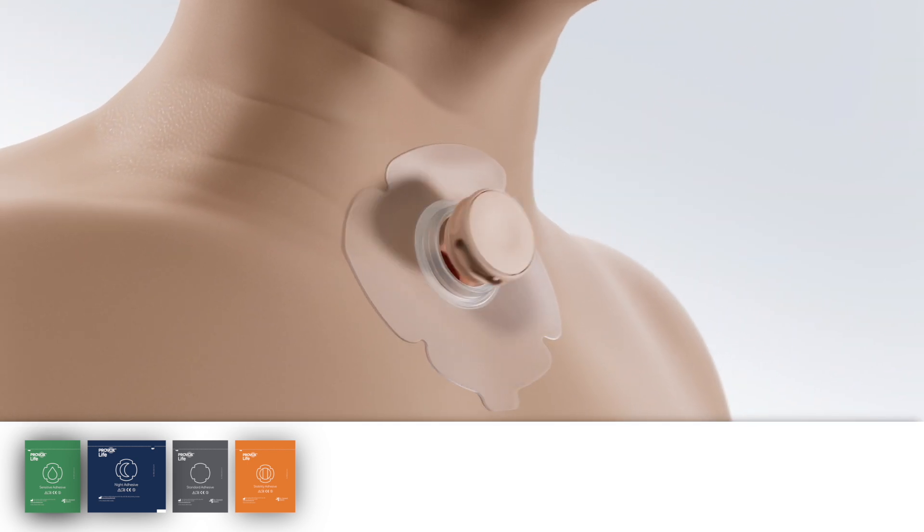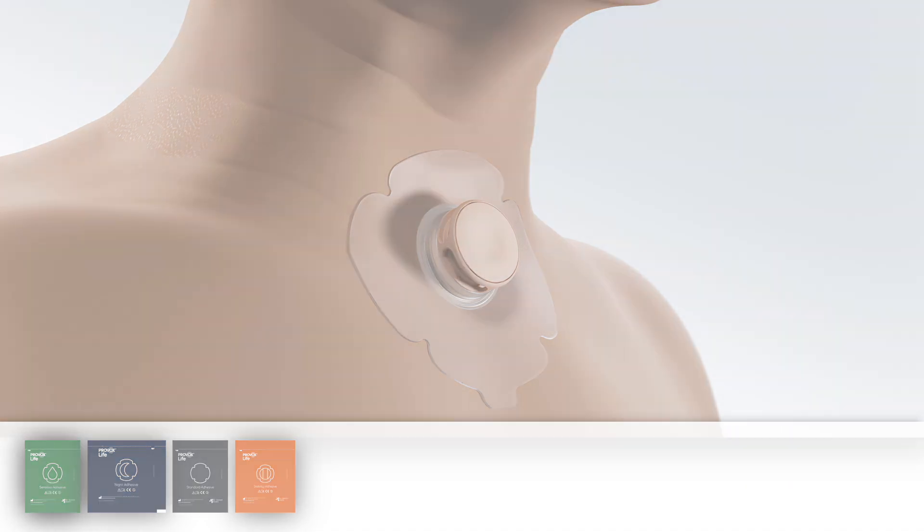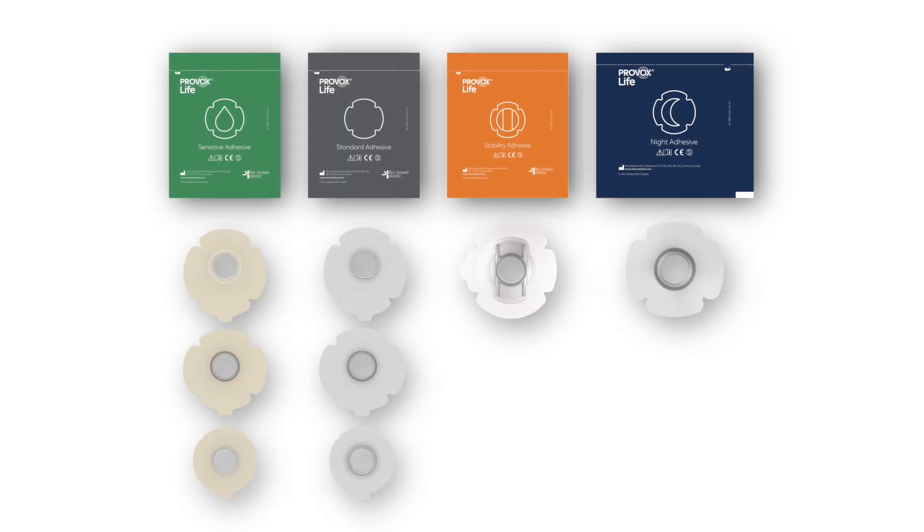The entire range of Provox Life adhesives are clover-shaped. This design provides a better fit for more comfort, and they are suitable for a variety of skin types and stoma contours. Sensitive and standard adhesives are available in three different shapes: round, oval, and plus, to fit individual needs.